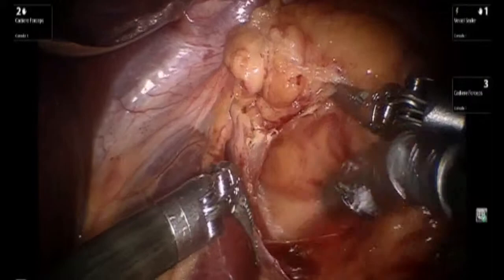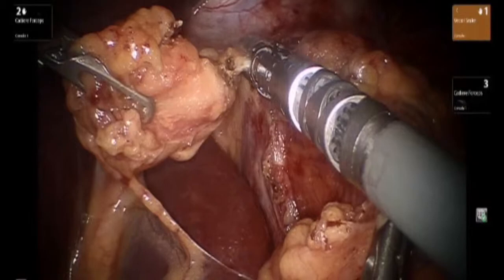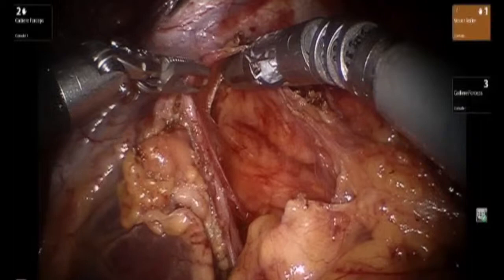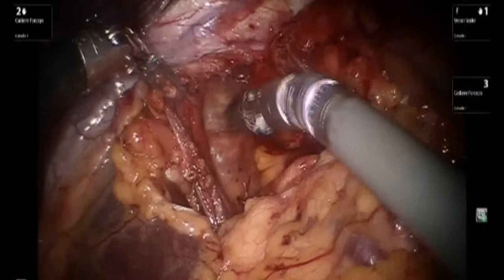This dissection allows for better visualization of the structures in the posterior mediastinum on the right side, with the goal of identifying the right and the left crus coming together at the base. The attachments have to be mobilized and freed up circumferentially and completely in order to allow for complete reduction of the herniated structures and to minimize the risk of recurrence of the hiatal hernia.